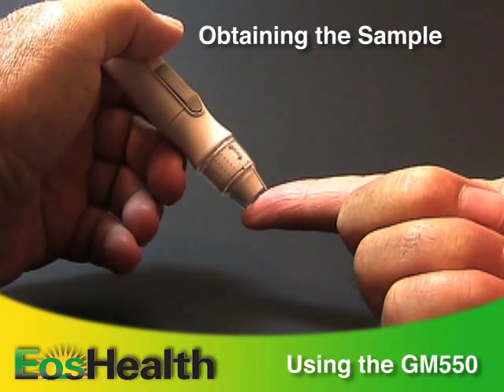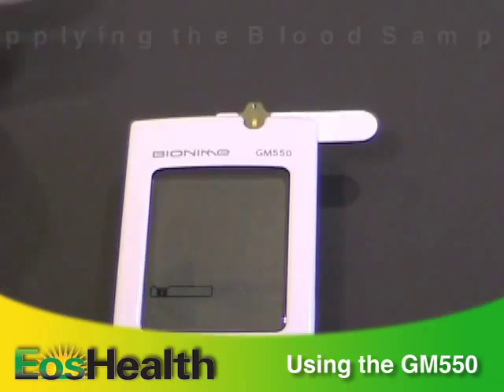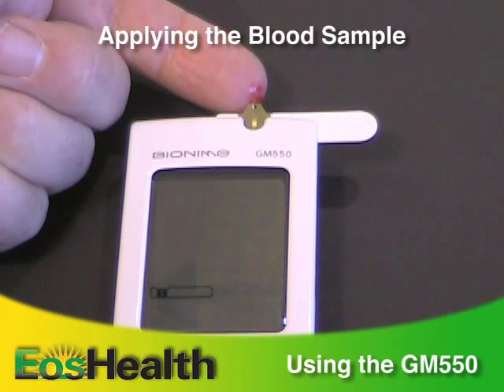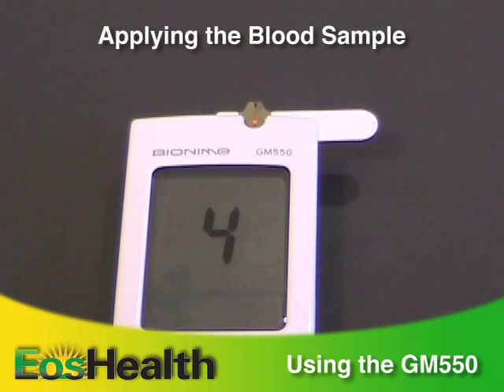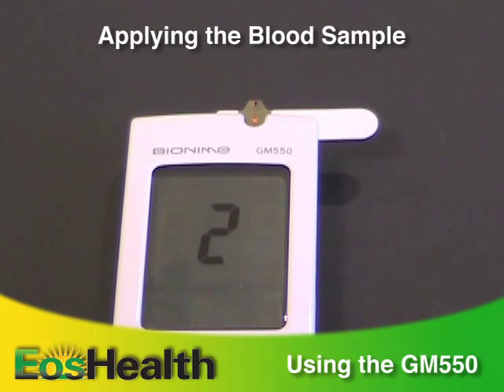Instead of your finger, you can also prick your palm or forearm. Touch and hold the drop to the edge of the test strip until you hear a beep. The view window should be totally filled with blood. You'll see the countdown mode on the screen.